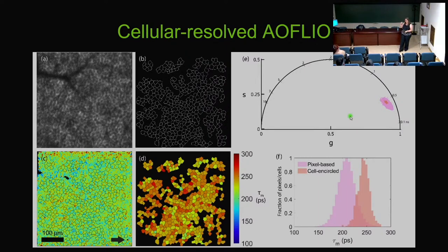And I don't have the data here, but as we start to move to other excitation wavelengths, other spectral emission collections and narrowing down emission bands, we start to lose photons. As we start to lose photons, it becomes very difficult to analyze in the pixel-based way that we were doing on the left. By doing this, we'll actually be able to expand the number of spectral properties that we can consider, the number of smaller spectral bands that we consider, and start potentially delineating those into smaller regions. That's exciting to look at potentially sources of different fluorophores. The other thing that's interesting is just looking on a general global scale, how do those change?